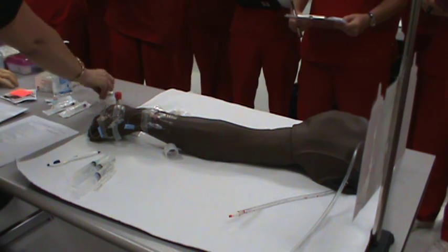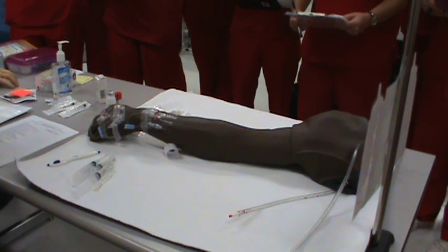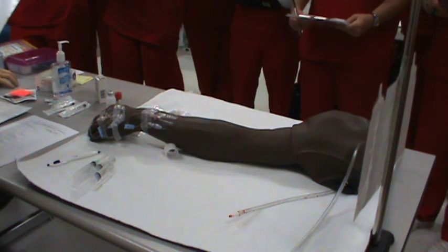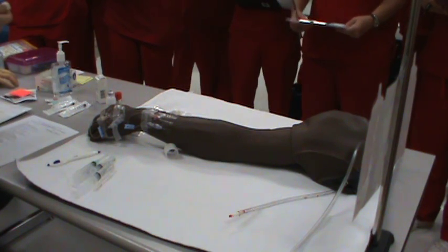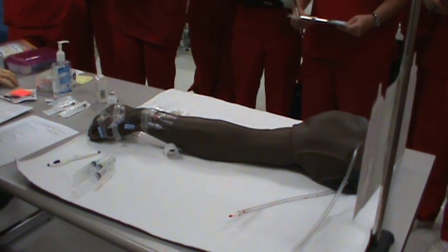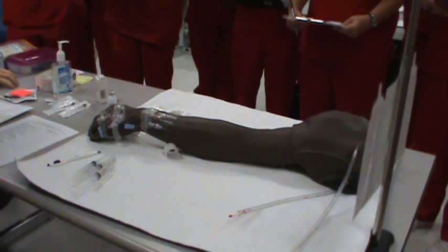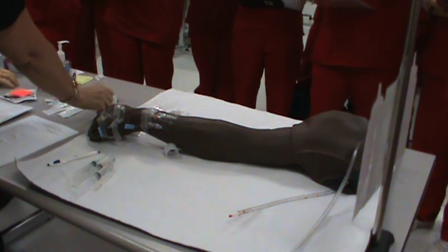Prepare your medication correctly. So I have a Solu-Medrol. My order says patient has calcium gluconate 10% at 70 mLs an hour. Today, you're going to give Solu-Medrol 80 milligrams IV push now. I have a vial with 125 milligrams per 2 ml, and I have a 40 milligram per 1 ml. Which one am I going to use? He needs 80. I'm going to use the 125.